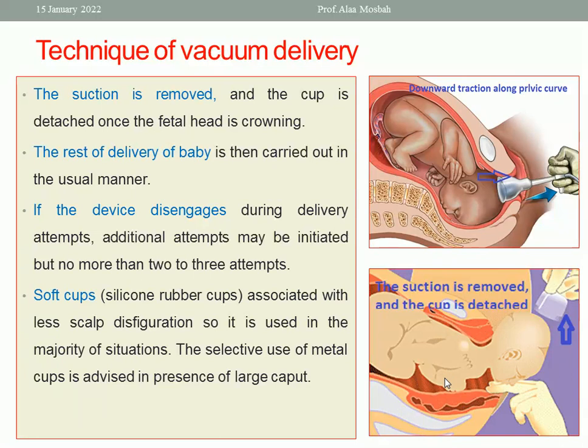What if a problem happened during traction, the device disengages, the cup detached? Okay, so try another attempt. How many trials can I do? I can do from 2 to 3 attempts. If failed, there is no more trial.